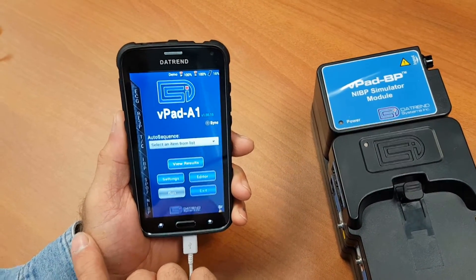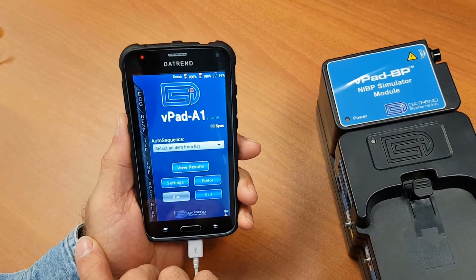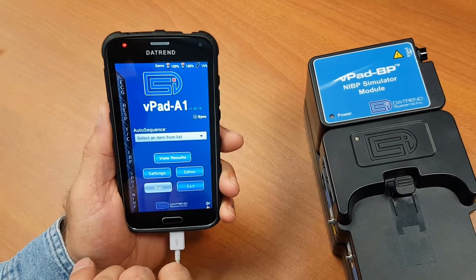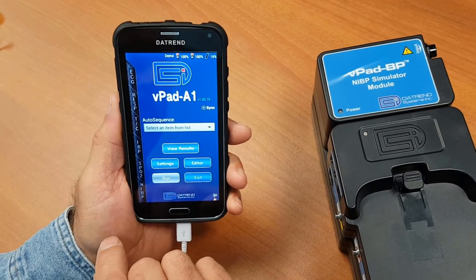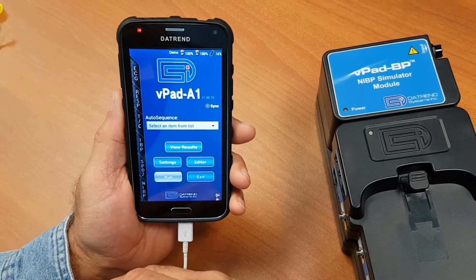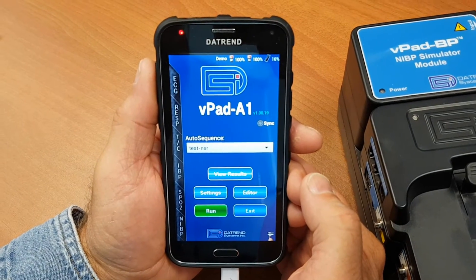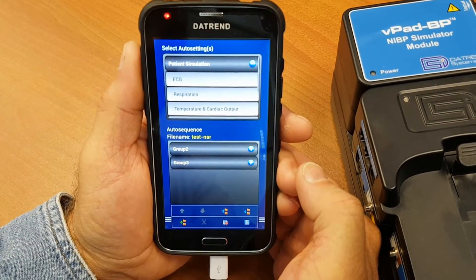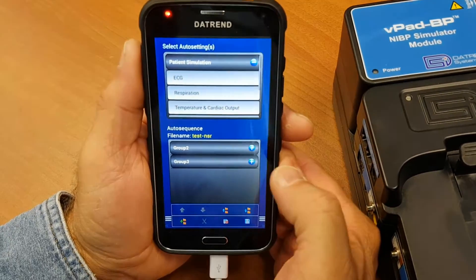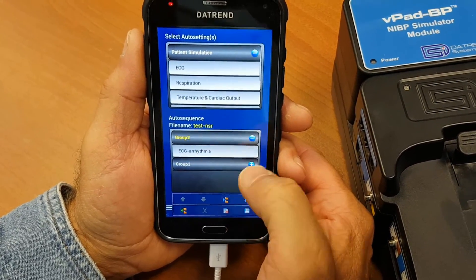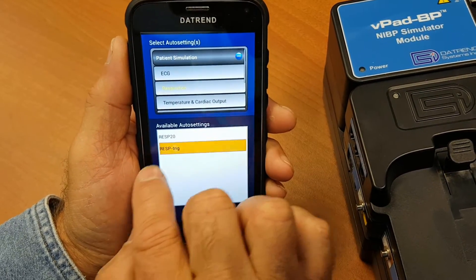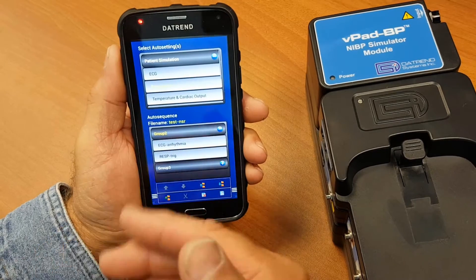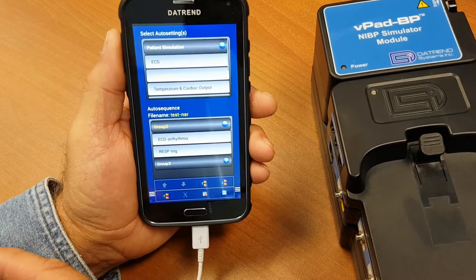An auto sequence is a series of numerous auto settings. You can set it up so that there's one group of settings for ECG, respiration, and IBP, for instance, and once that test has been done it will go on to the next in sequence until it completes the full auto sequence. You can create a new auto sequence from scratch or edit an existing one. You add parameter settings to each group — for example, ECG arrhythmia plus respiration — and when running a test you go through each group, generate a test result, and save the information to a file when completed.